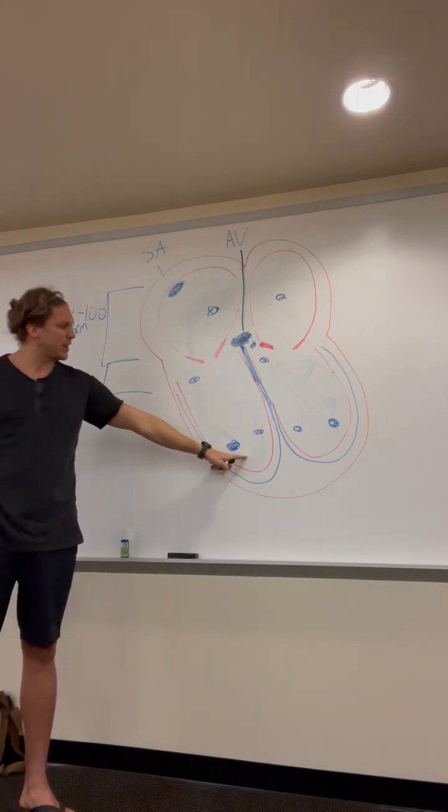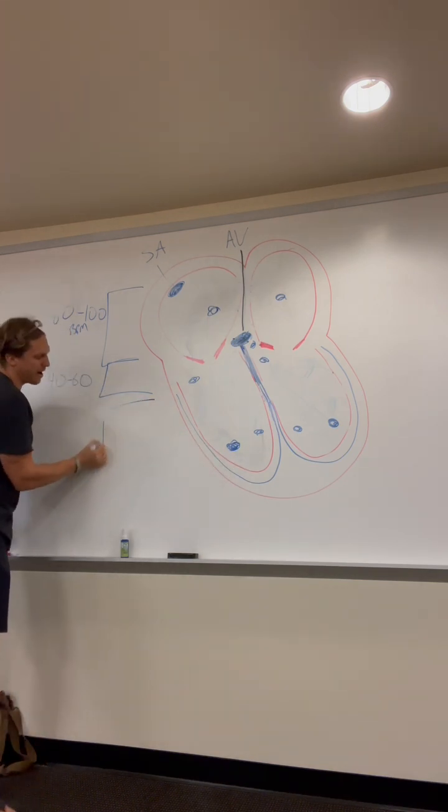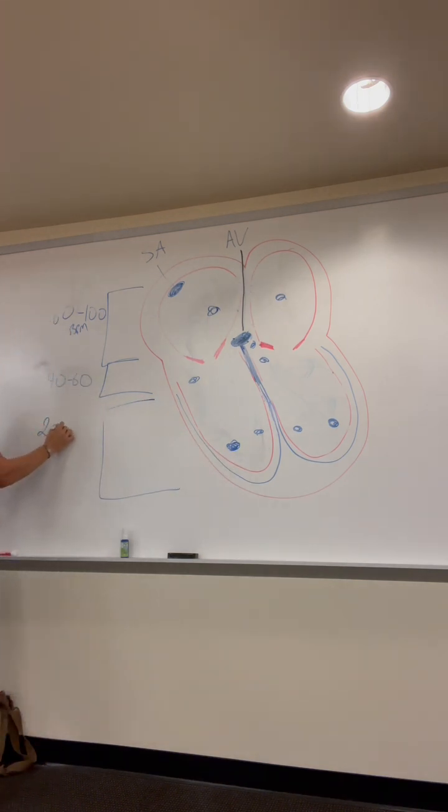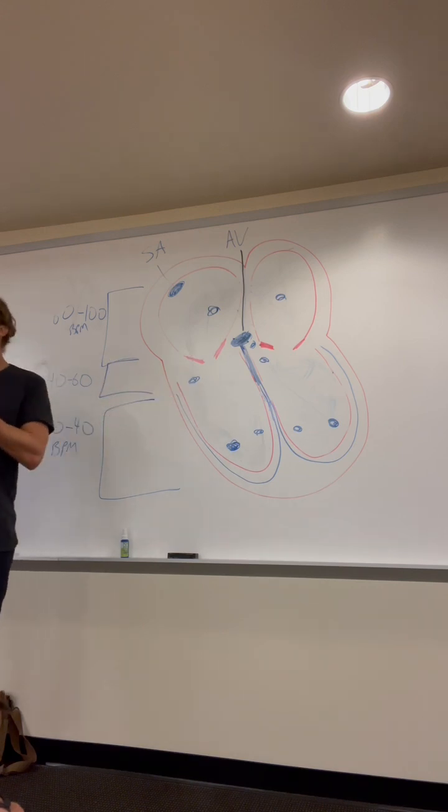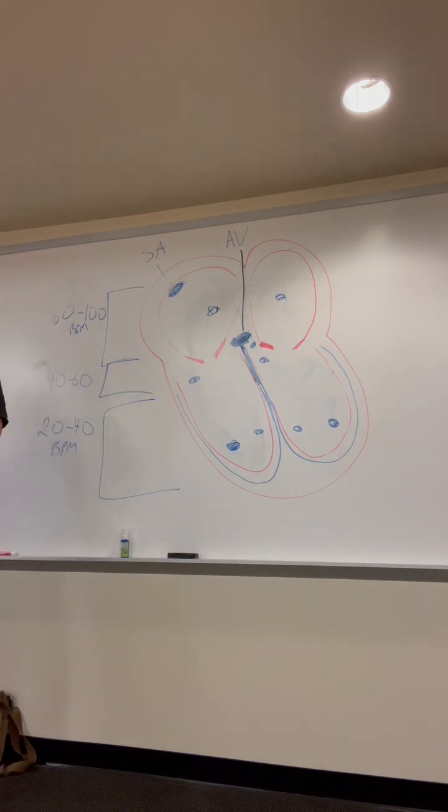And then all the way down in the ventricles, these foci have an intrinsic rate of 20 to 40 beats per minute. And this is important in helping you try to identify these idioventricular rhythms and agonal rhythms, knowing the intrinsic rate of these foci. Now, junctional ones, there is an accelerated junctional. There's a tachycardic junctional, okay? And I'll show you guys how to differ for that when we get to the junctional rhythm.